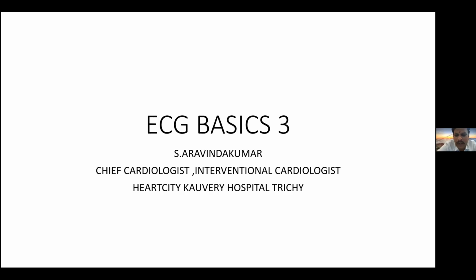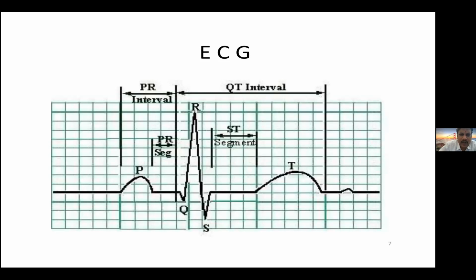So today we will be taking an interesting session. Until now we were looking into the rate, rhythm, and axis. And from there on, we moved to the P wave, PR interval, and QRS complex. So now we'll move on to the next session with the ST segment.